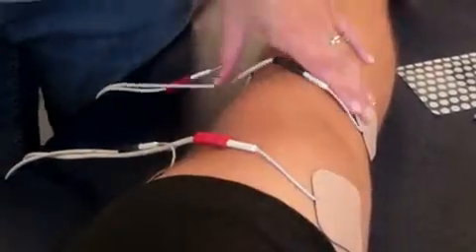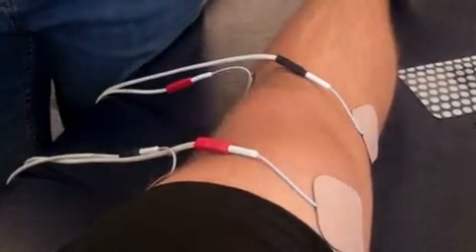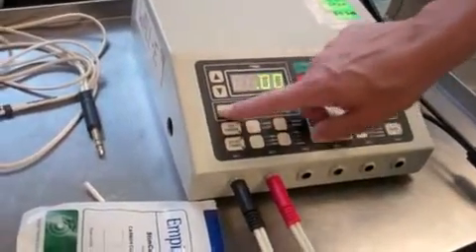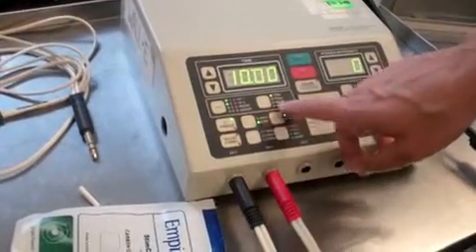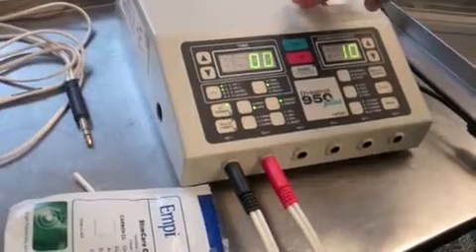We inspect the area and then clean the site. Typically we use interferential for primarily just sensory level. If we're going to use interferential for motor level, we're just going to adjust the parameters. We can restart interferential, and if I want motor level pain control, I put the frequency on low, which means it's going to modulate between zero and ten pulses per second.